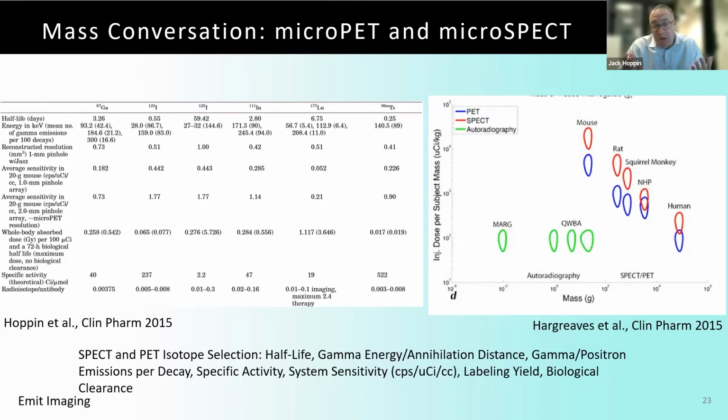And oh, by the way, we're doing biological research, so all things are not equal. I put this here just to say I think it's not a simple conversation to understand isotope selection and the impact on your image quality, and it really varies on the task of what you're doing. What is clear on the right is that the microSPECT and the micro tomography instrumentation was 20 years behind the clinical, largely due in part to the fact that rodents are a couple thousand times smaller than humans.